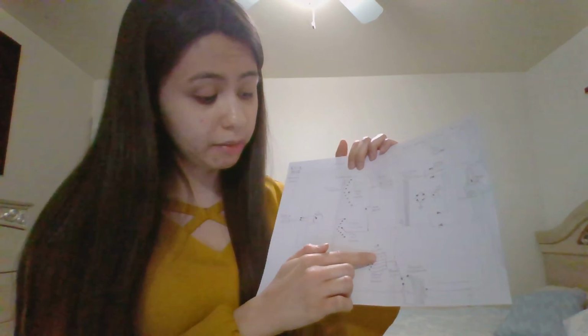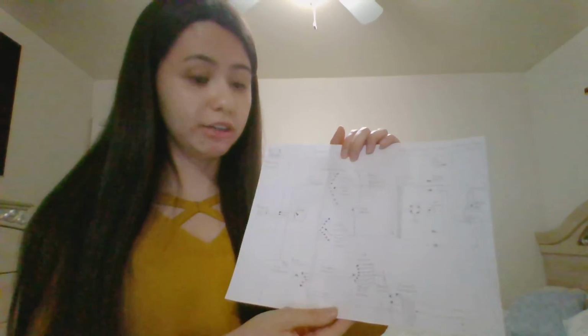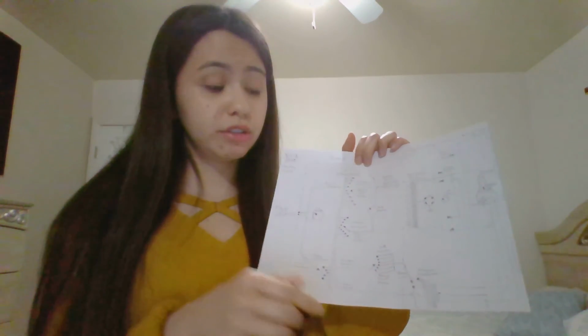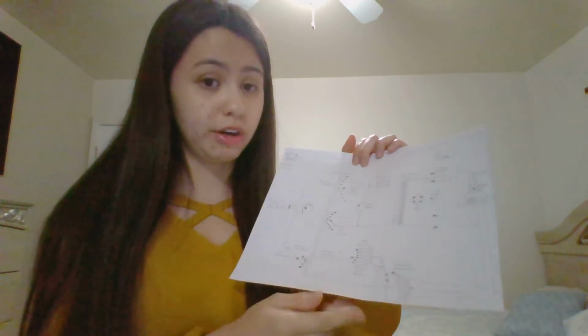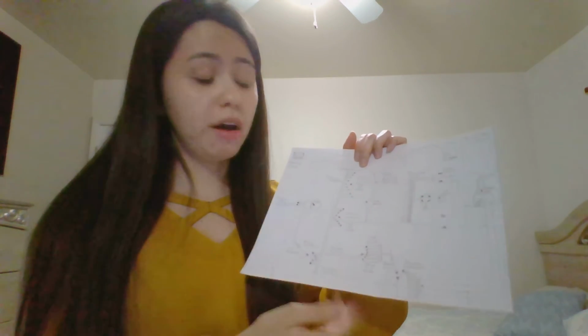It's going to go through these filament circuit resistors and go down to the filament transformer. And the filament transformer is actually a step-down transformer, so we're going to decrease the voltage, but we're going to increase the current. And we want to increase it to about 12 amps in this case. And then we're either going to choose the large or small filament, depending on if we want to use a large or small focal spot. And then that's going to lead on through to the cathode.